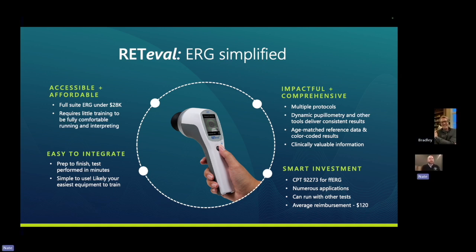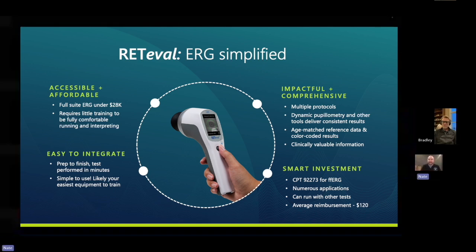You know, when I took over as our chief of electrodiagnostic in 2010, I graduated in 2009, finished my residency in 2010, and took over our electrodiagnostics department. And I have seen this technology evolve and evolve and evolve in the last 15 years. It used to be that you had these great big sensors that you had to put right on the ocular surface, so the electrodes were more invasive. The testing took longer. We had to dark adapt patients. And we still occasionally do, for example when we're trying to separate the rods and cones and rod cone dystrophies and retinitis pigmentosa, you can choose to do that as well. But for every patient 15 years ago, we would sit them in the dark and dark adapt them, both eyes patched, and sit there for 30 minutes, 40 minutes. That's not private practice. That's not electrodiagnostics as it is today.